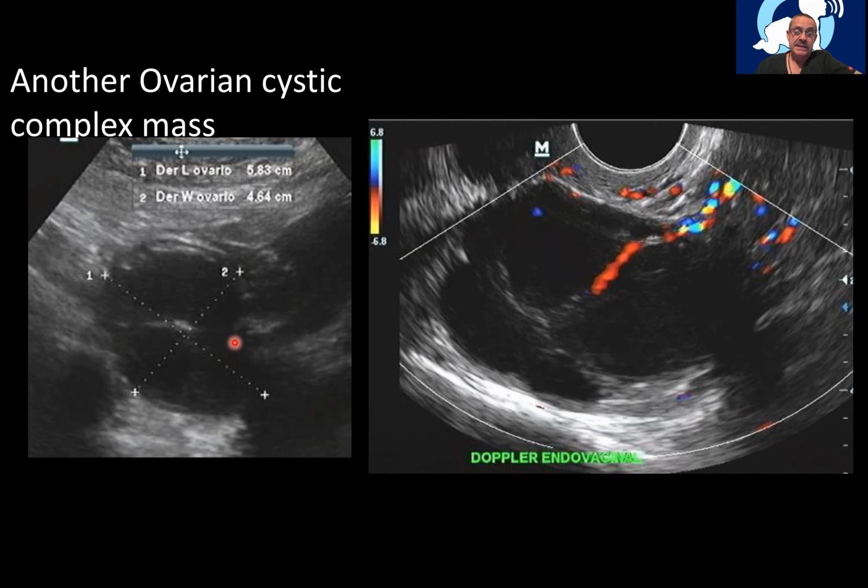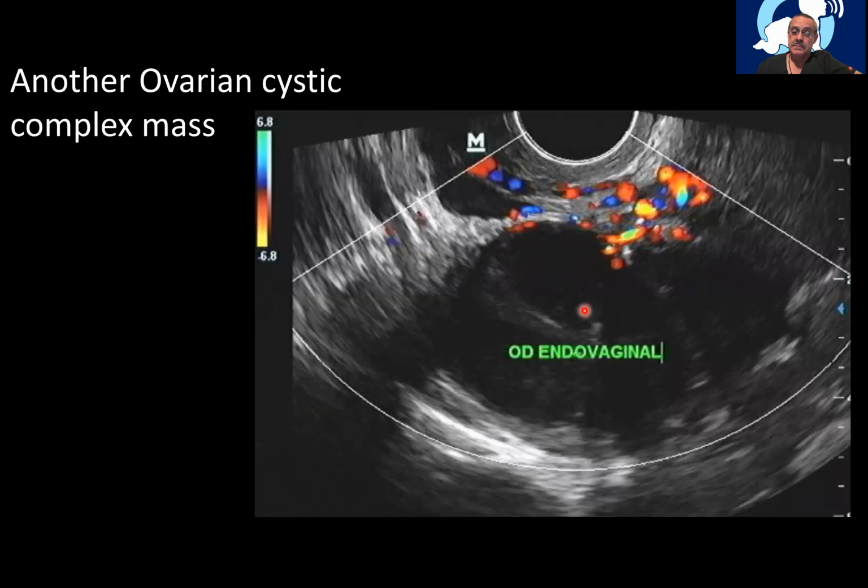Another ovarian cystic complex mass with clear vascularization of the septations. This whole thing is the mass.